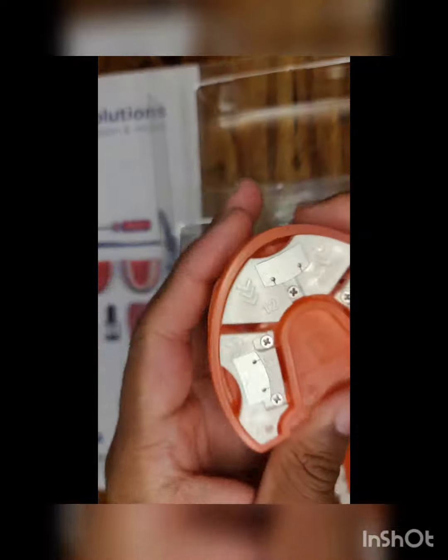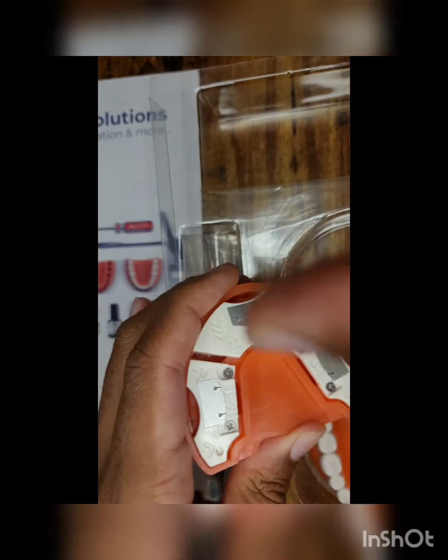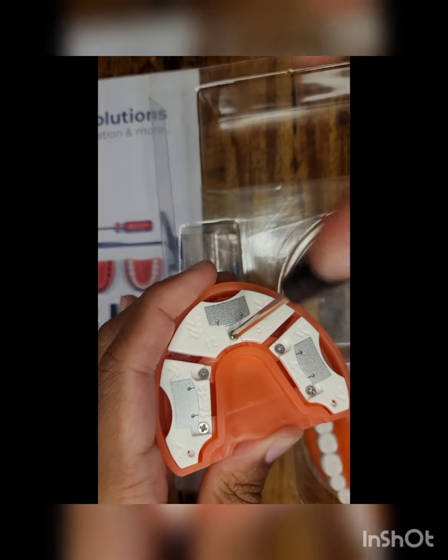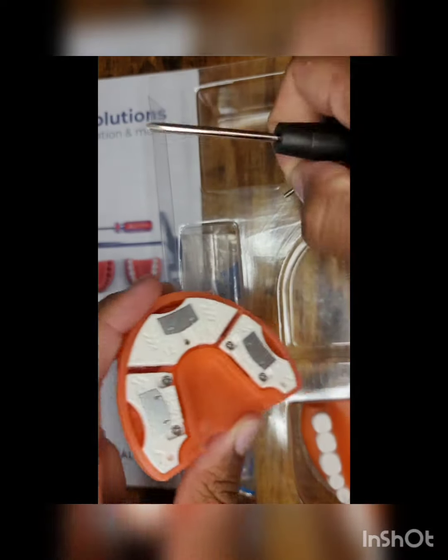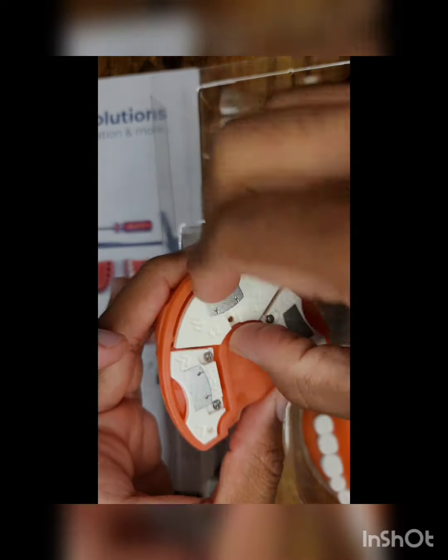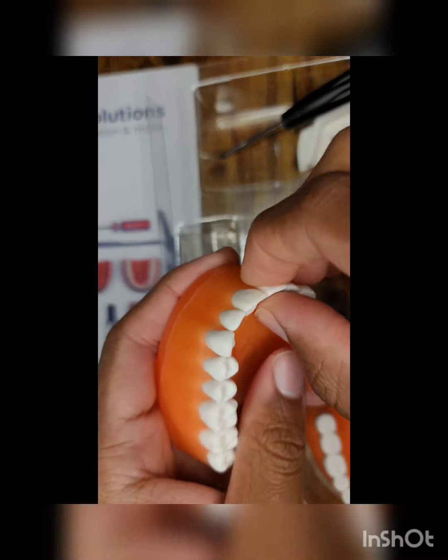Going back here, we can just go ahead and unscrew this. It takes a little bit of effort, but not too much once you find the right rotation. Just take out the screw — be sure to hold on to it — and then just slide down the right piece. And there you go. Under there you can actually see all the teeth.